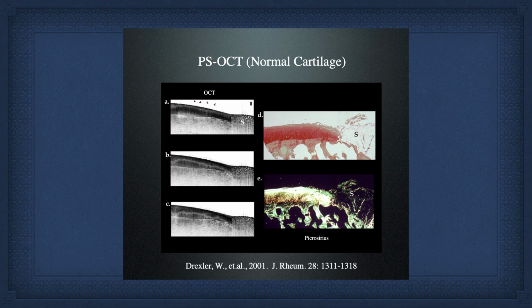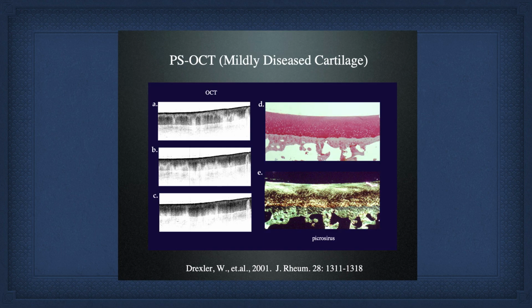We don't have a bunch of bands, but the band is smoothly moving as we change the polarization state. Now, here is where matching on a micron scale is critical, because dropout areas of collagen, if you're 500 microns off, you're not matching. So if we look at the lower right, there are areas that aren't lighting up in the image.